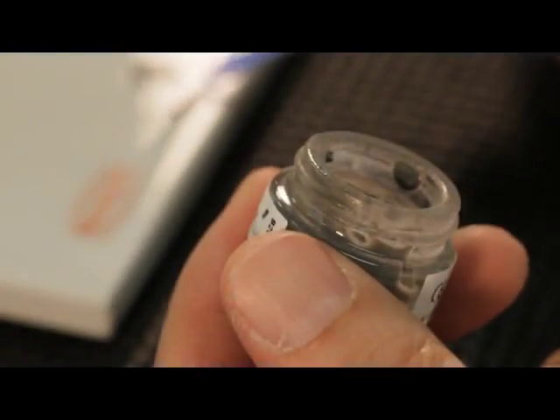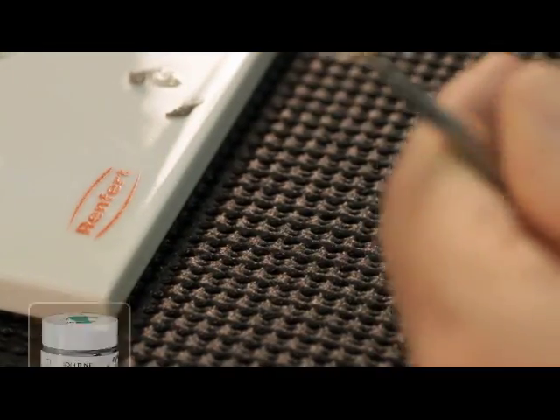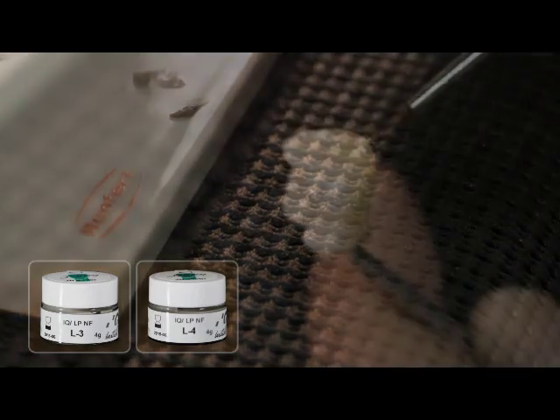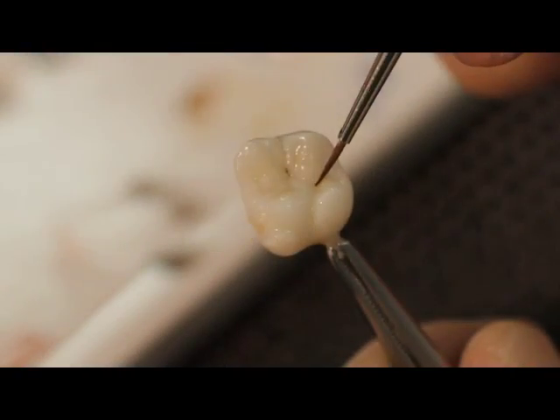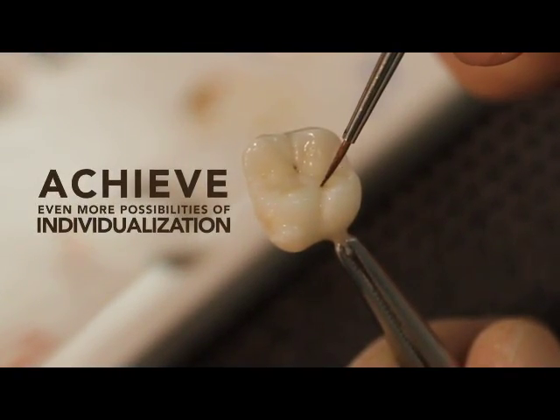In order to achieve an even higher transparency, the two grayish effect Lustre Paste NF, L3 or L4, can be used as well. All GC Initial MC and Vivo stains can also be incorporated to achieve even more possibilities of individualization.